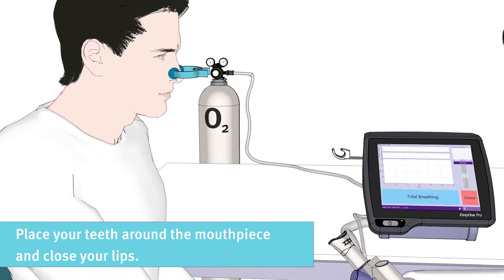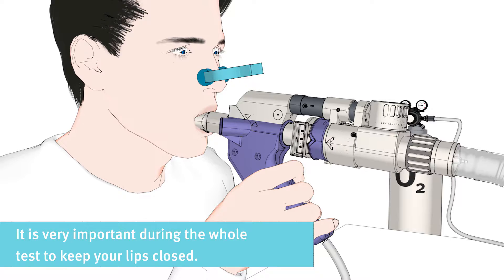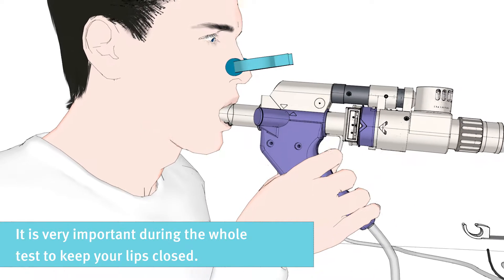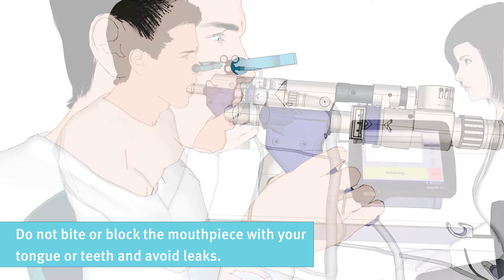Please place your teeth around the mouthpiece and close your lips. It is very important during the whole test to keep your lips closed. Do not bite or block the mouthpiece with your tongue or teeth, and avoid leaks.